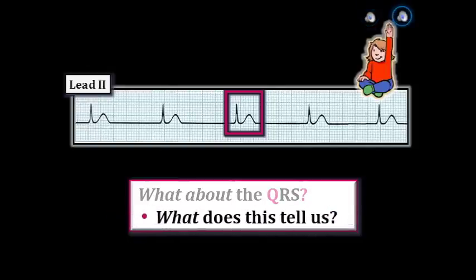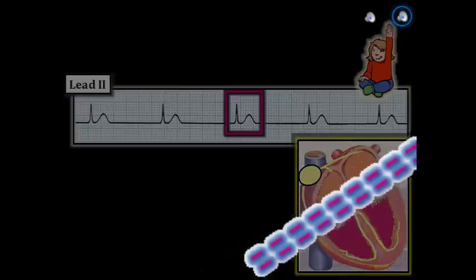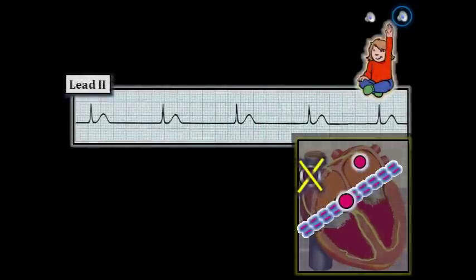As we discussed in part 1 of this video series, and assuming that the QRS is truly narrow in all 12 leads of this patient's ECG, knowing that the QRS complex is narrow tells us that the rhythm is supraventricular, that is, originating from at or above the AV node, or from at or above the double dotted line in this figure. The number of possibilities is limited. They essentially include sinus rhythm, an atrial rhythm, or an AV nodal rhythm. This rhythm is not sinus because there is no upright P wave in this lead 2. It is also unlikely to be an atrial rhythm because we don't see any P waves at all in this lead 2. This essentially defines this rhythm as an AV nodal escape rhythm.